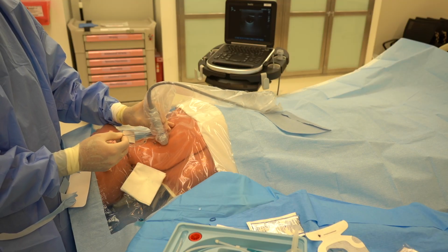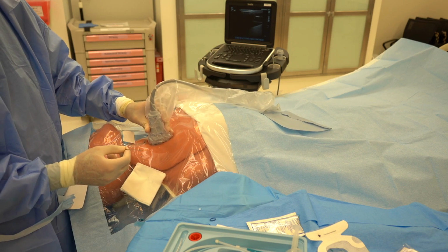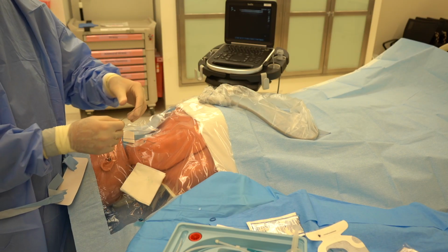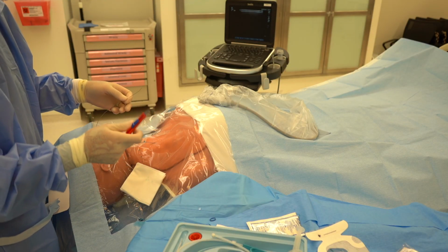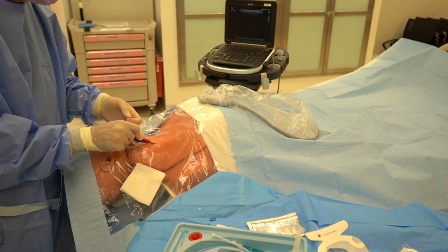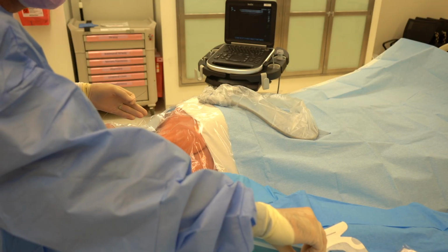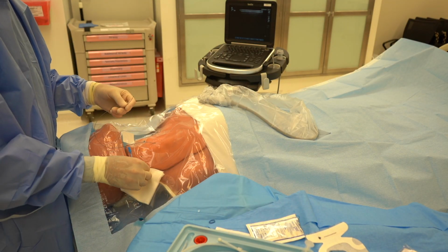And we're verifying our wire in the transverse view initially, out of plane, and then we're switching to an in-plane longitudinal view, and you can see the wire there comfortably resting on the bottom of our internal jugular vein. We're going to make a nick with our scalpel and think thoughtfully about how large of a nick we need in order for our catheter to penetrate the skin. You may have a little bit of additional capillary bleeding at this point, so having some gauze handy can be helpful.